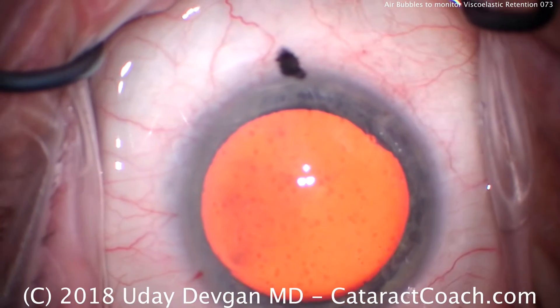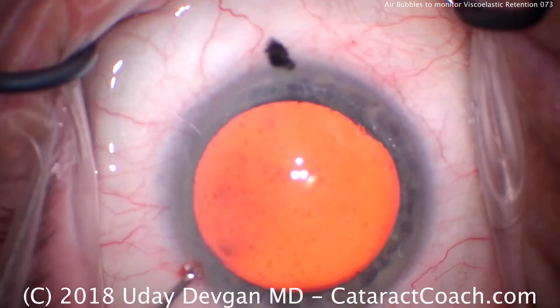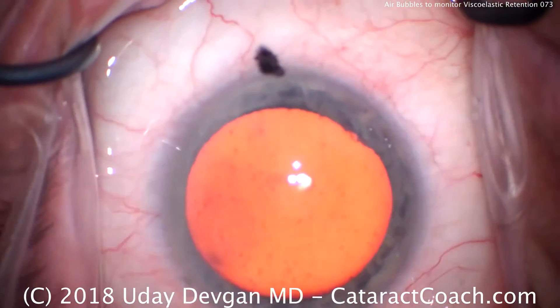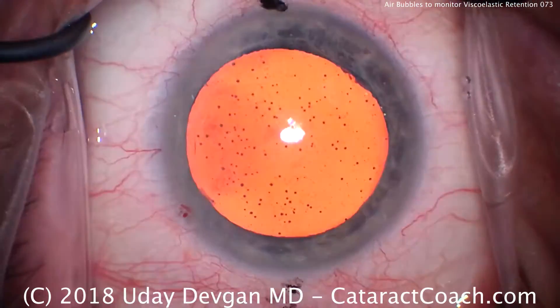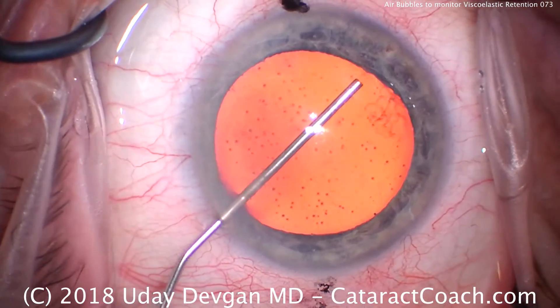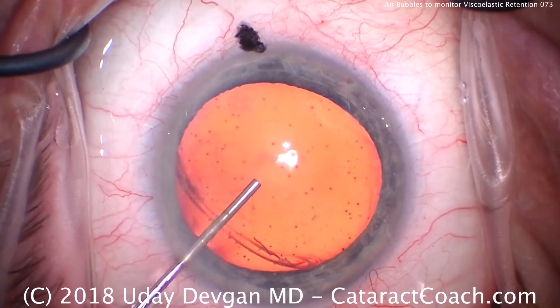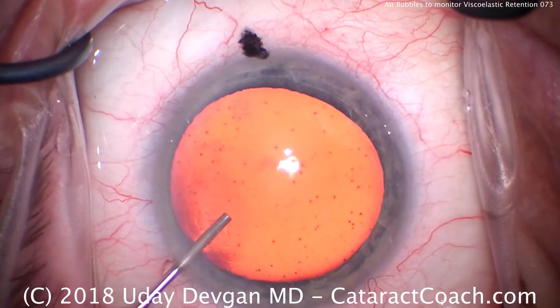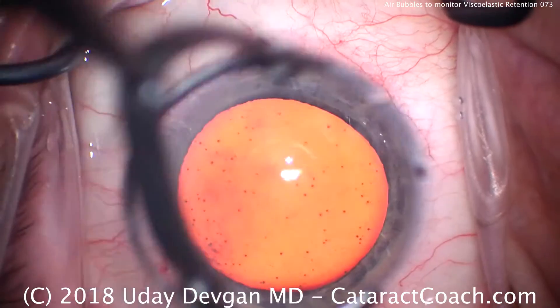We get a tremendous number of air bubbles on the undersurface of the cornea, right against the endothelium. Look at this picture here. All those little dots are little tiny air bubbles. So we'll instill the dispersive viscoelastic now, and it'll push and keep those air bubbles in place. Now we still see air bubbles along the corneal endothelium, held in place with the viscoelastic.